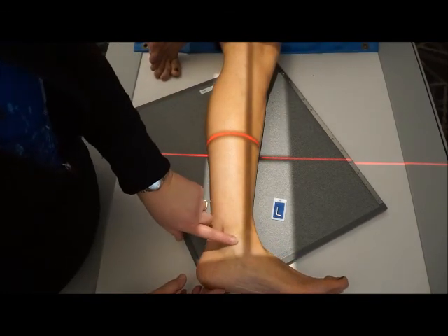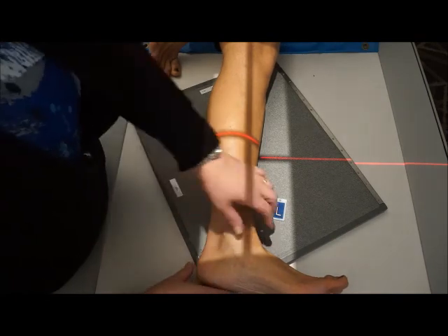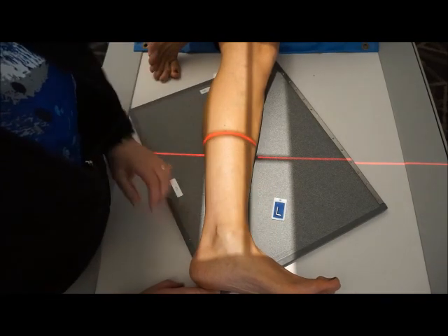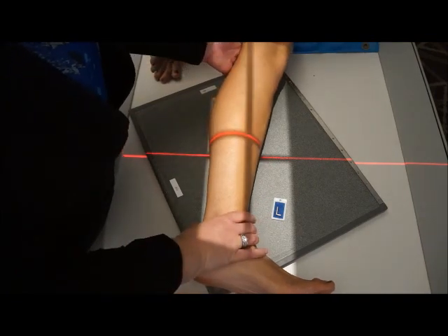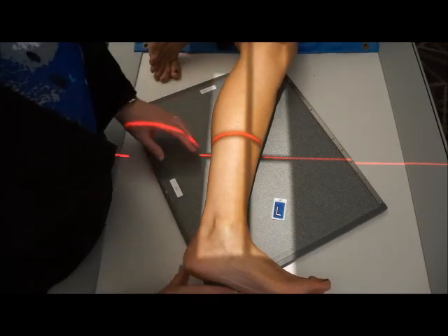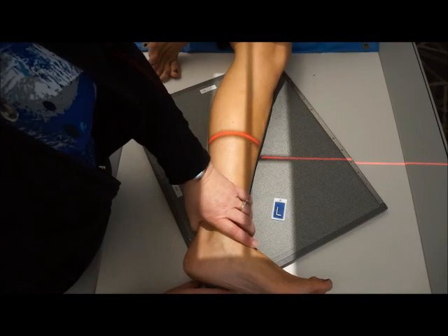Over here I'm palpating the medial malleolus, so I know I've got the lateral one a little bit longer and I've got quite a bit of distance here. I'm going to bend the knee just a little bit and have you slide down a little bit more.